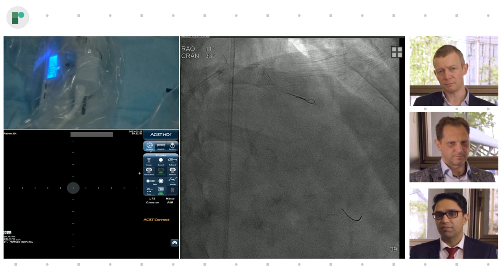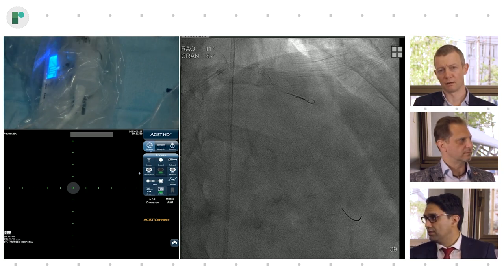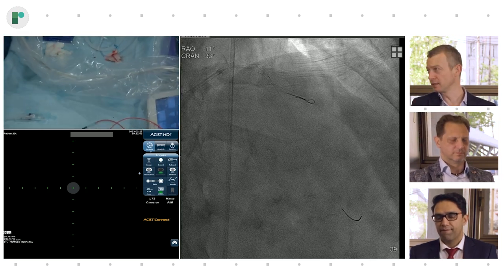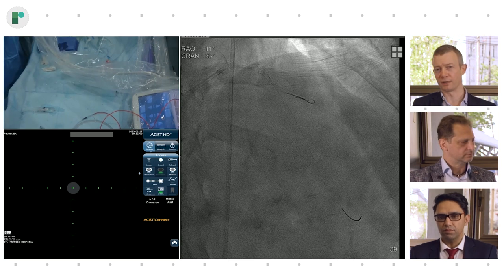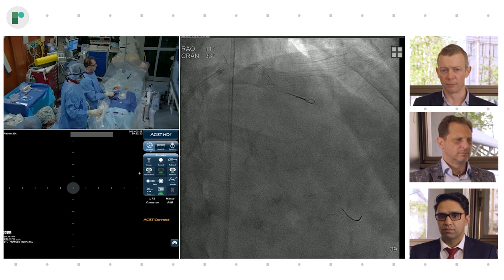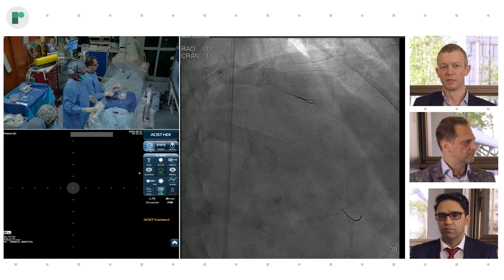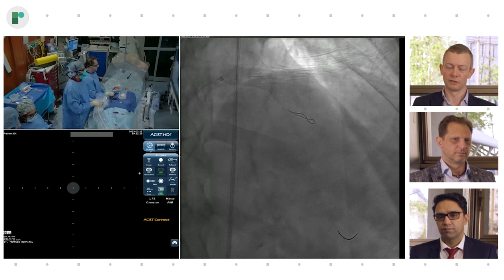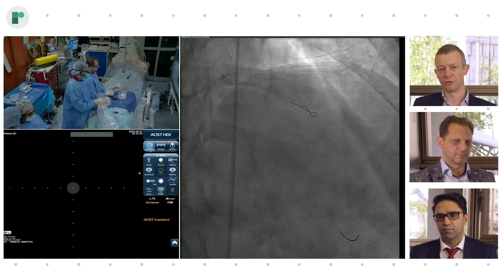So you can see we set up the IVUS catheter in about a couple minutes. But you just demonstrated the flushing part, and that's critical, right? Yeah. I mean, irrespective of the brand you use, if you don't flush and prepare it properly, you will get air bubbles, and you will lose the signal at the moment supreme during the pullback. So really take 1 minute to do it properly, and you will enjoy the benefits of the imaging catheter.